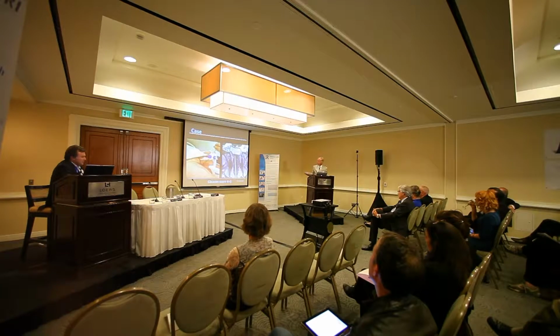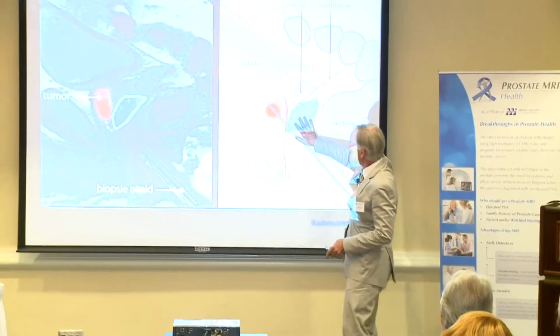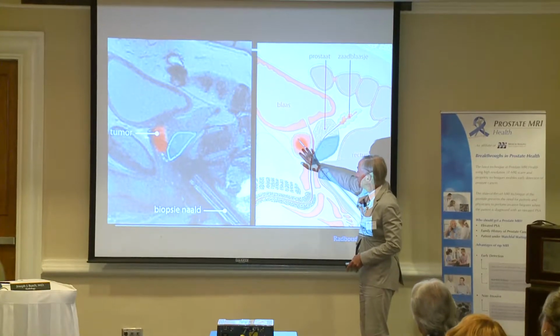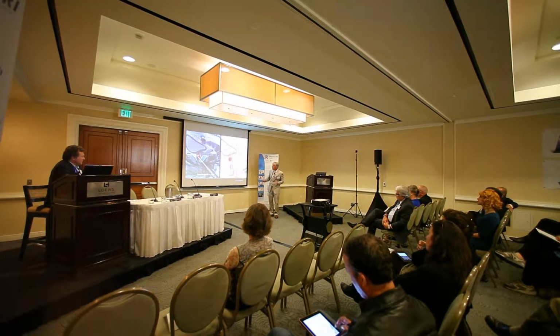Now the question is, why do you miss this lesion with TRUS biopsy? Well, with TRUS biopsy, you actually biopsy only this part of the prostate. This is the lateral view, so you look at the patient like this, from the lateral side. So this is the bladder, the front side. This is the rectum, you see the pubic bone. This is the prostate, seminal vesicle, as you see here. And with TRUS biopsy, only this part is being biopsied. So an anterior tumor or a tumor at the base or even at the apex can be missed. So we need to do something, and the best way to do that is with MR guidance.